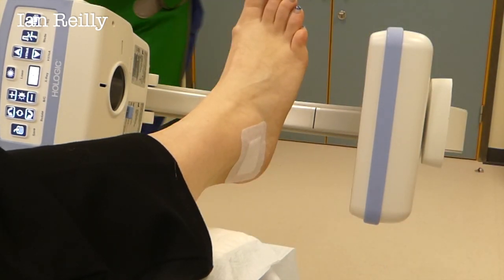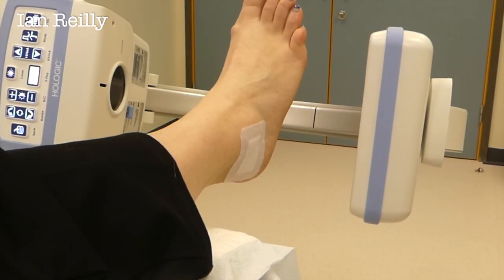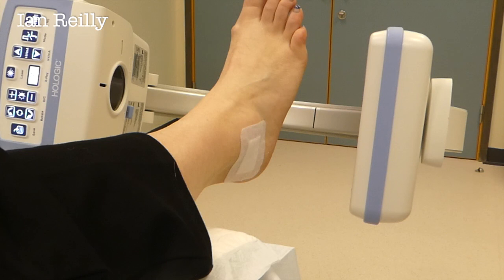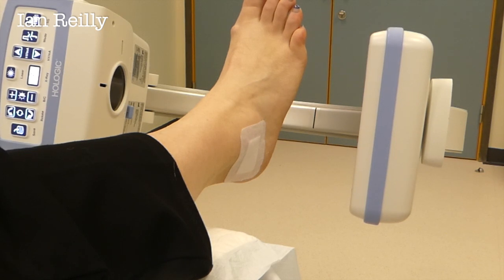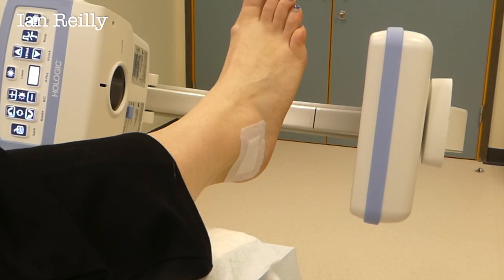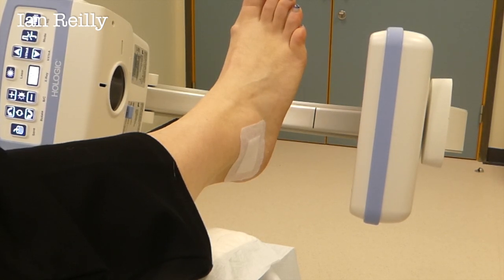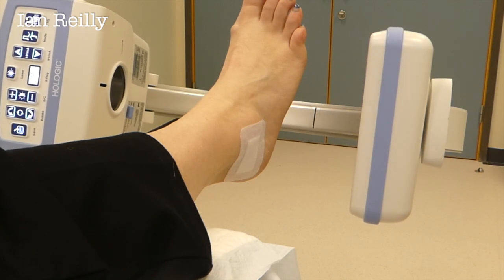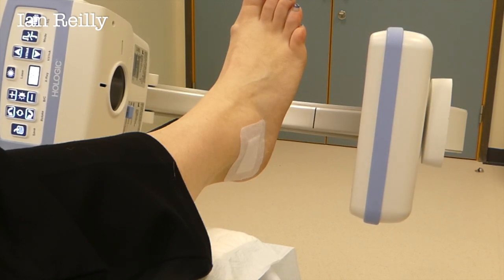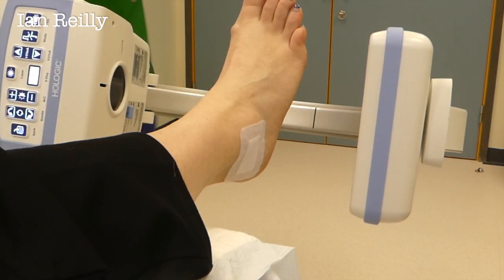Do you get any pain at the front of the ankle, Rita, as well? No. So that slightly resembles that — there's your heel bone, there's a bit on top, and that's a bit at the back, which is what we're treating now.